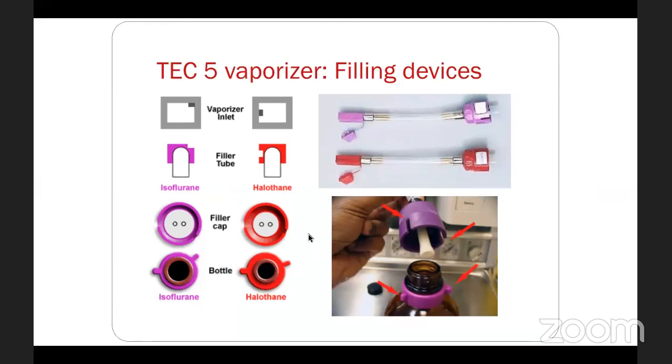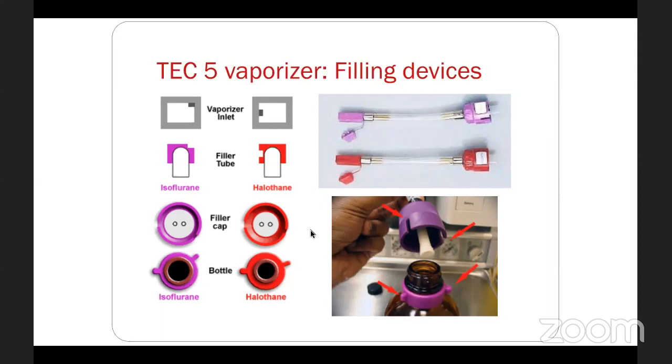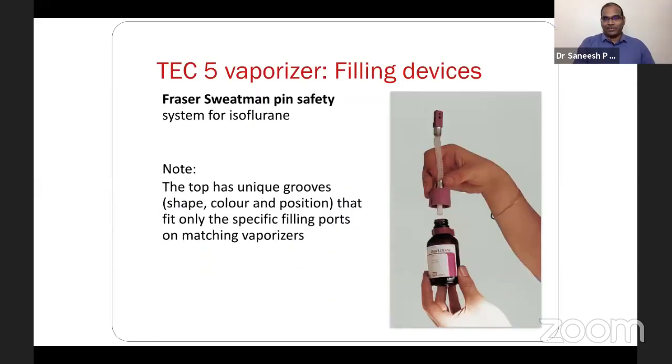If the key is not there, by manually pushing it, sir, we can fill. You have to struggle to fill. A little bit, sir. Lock and key principle. Little bit, sir. Okay, that is out of record.